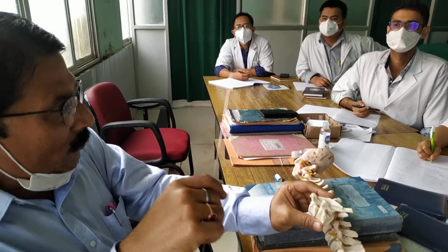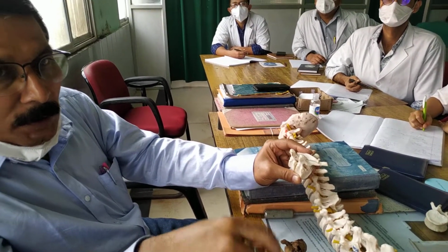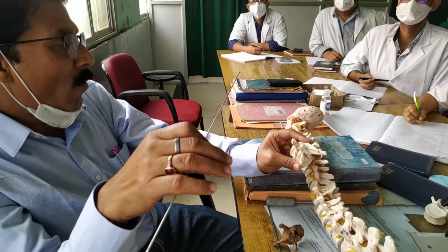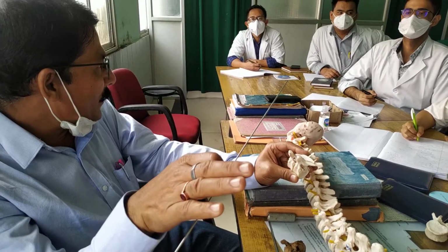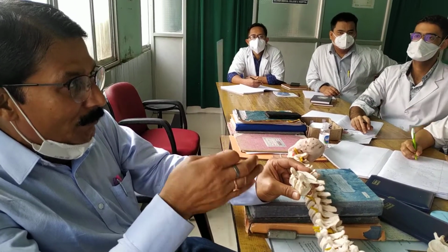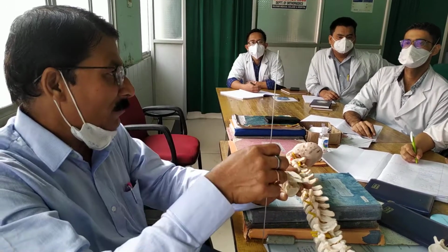Because of the position of the spine also, it may change. Sometimes somebody is hyperlordotic, somebody has lost the thoracic kyphosis, it may be flat. Yes? So that is why the actual angle may vary, but as such, grossly it is directed caudally, not perpendicular.